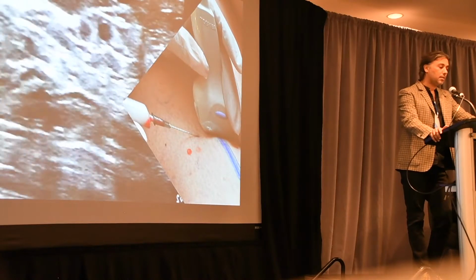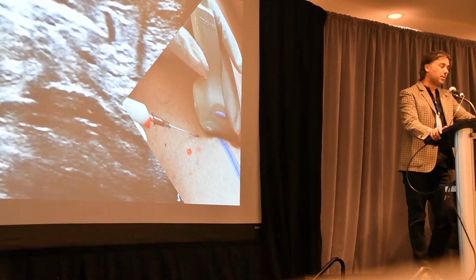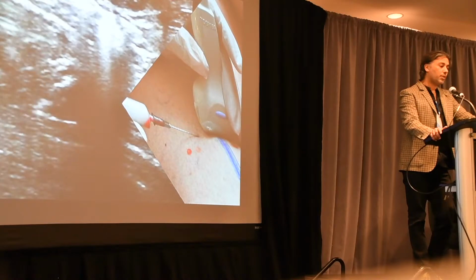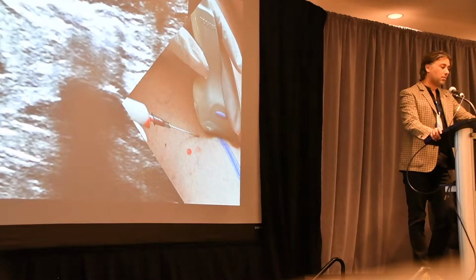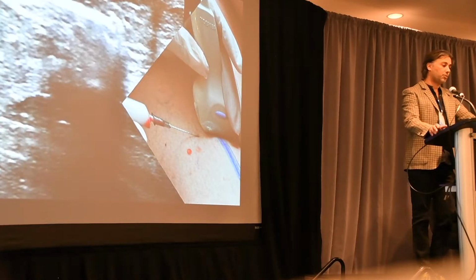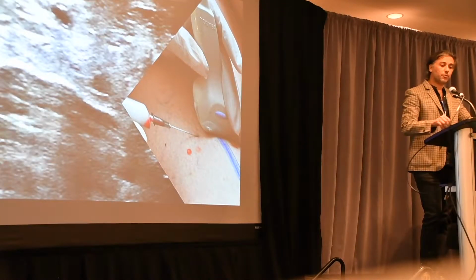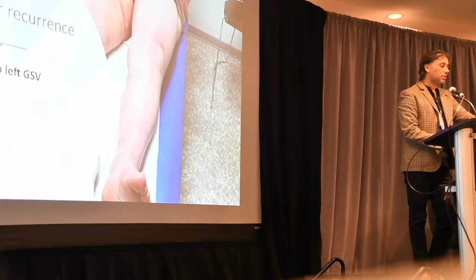Targeting the vein, we puncture the vein under control, shaft and tip are under control, and we inject without puncturing the small saphenous vein. You can see that after treatment, the small saphenous vein is not treated. Another report, this recurrence, it's a good indication for this approach.